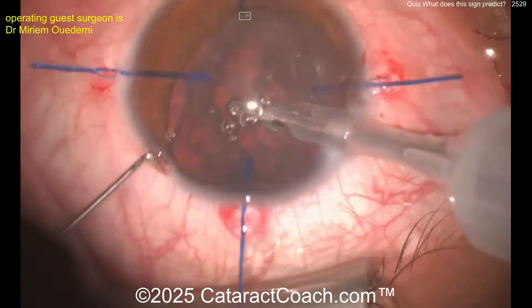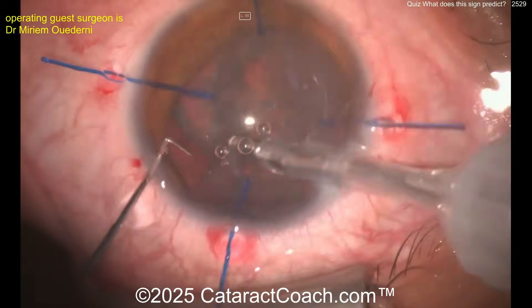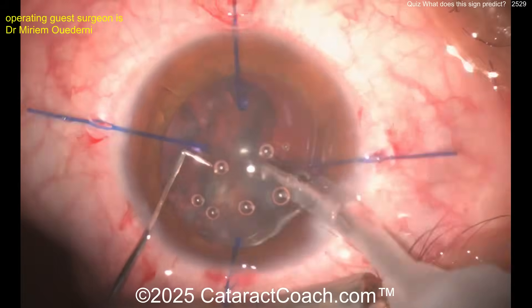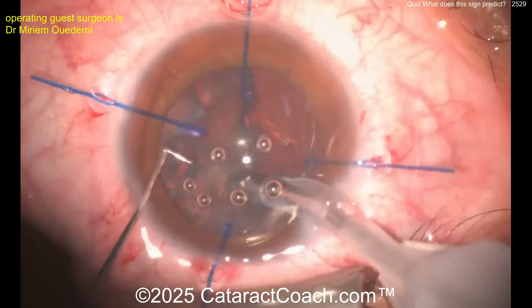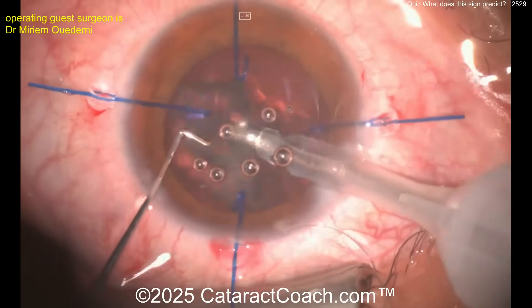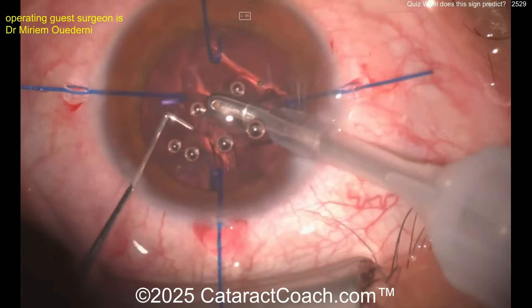The nucleus is to be removed pretty easily. This is probably a young person, because no phaco probe — just a coaxial IA probe to remove all the lens material. That looks pretty easy, getting all that lens material out fairly easily.